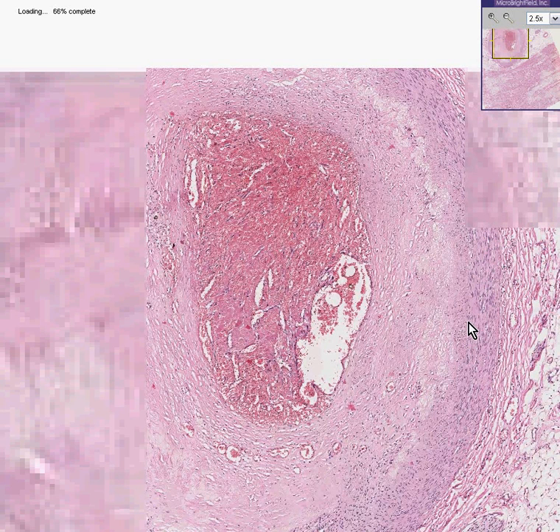In addition, what was left of the lumen, which looks like a relatively small percentage of the artery, looks like there may be some thrombosis as well, because you not only see blood in there, you could see little tissue fibers, and perhaps just some organizing phase of an infarct, perhaps in the days to weeks period. Now that we're thinking very logically, let's look at the heart that this artery was next to.